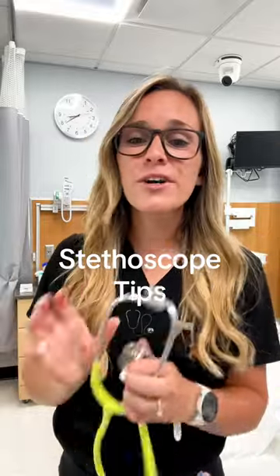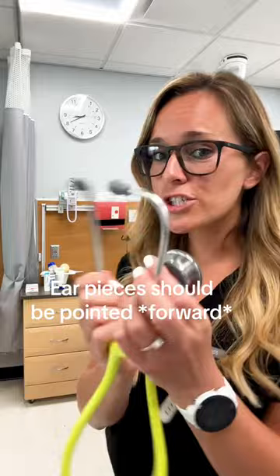For all my new nursing students, let's go over how to use your stethoscope. The first tip is that the ear pieces should be facing forward, and they're going to go in your ears like this.